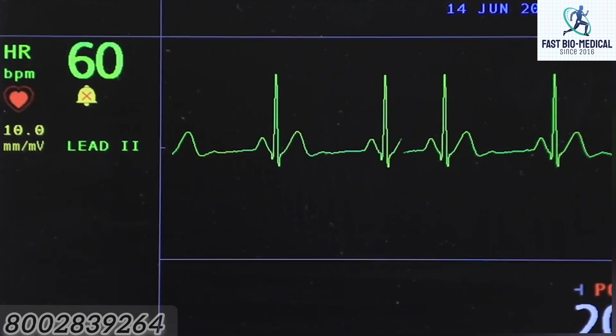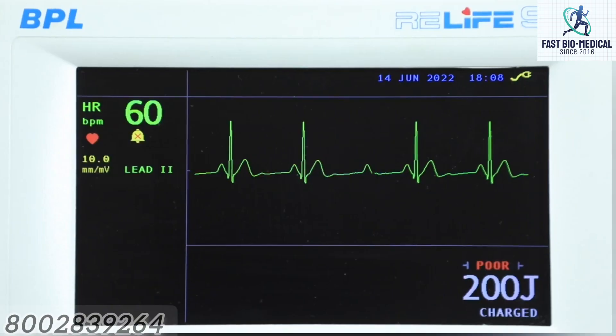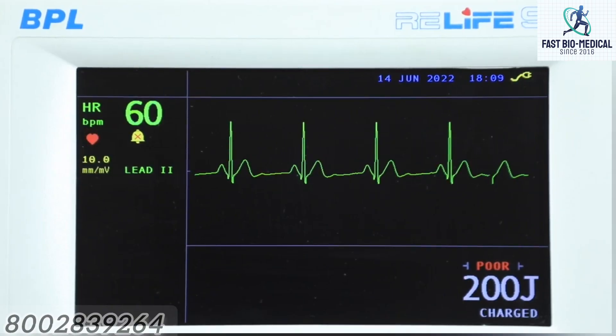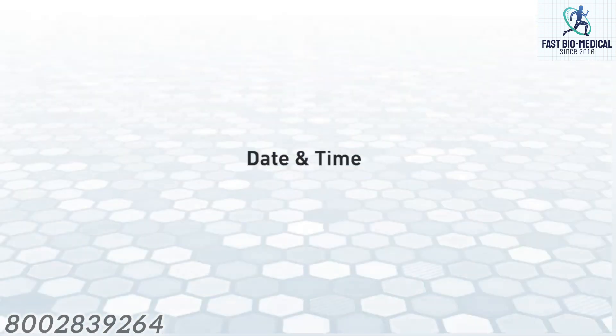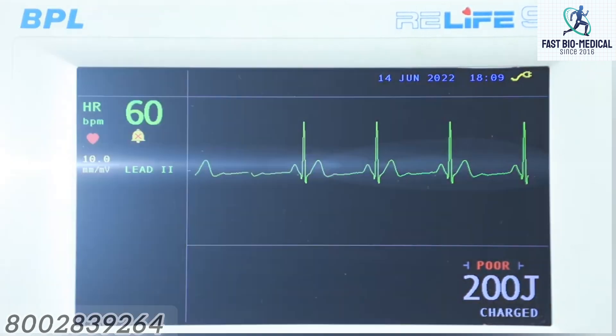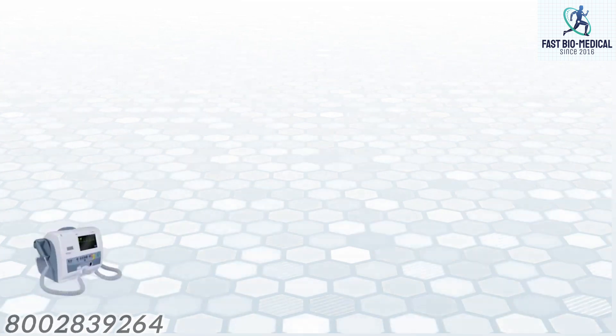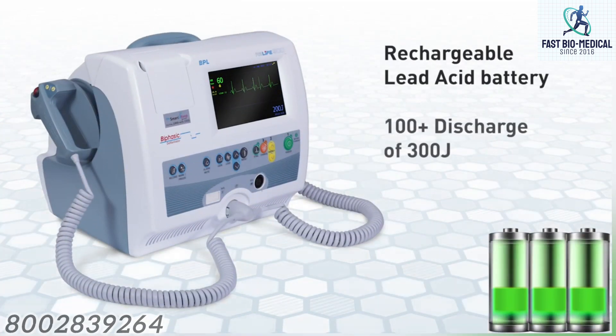ECG related information: the ECG signal trace is displayed in sweep mode at a rate of 25 mm per second. Heart rate from the displayed lead in beats per minute is displayed in this area. Current date and time are also displayed in this area.